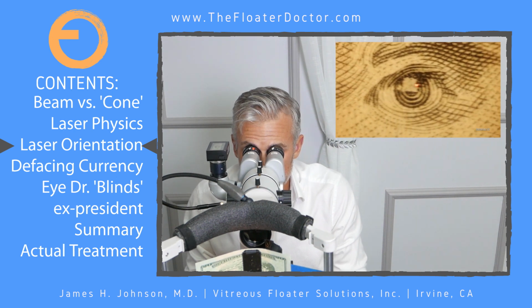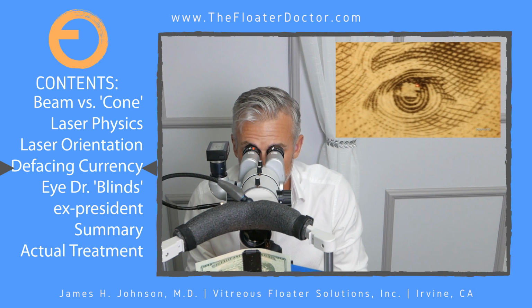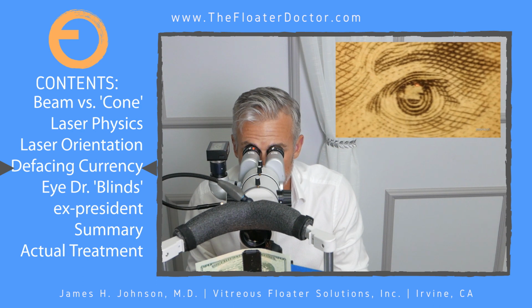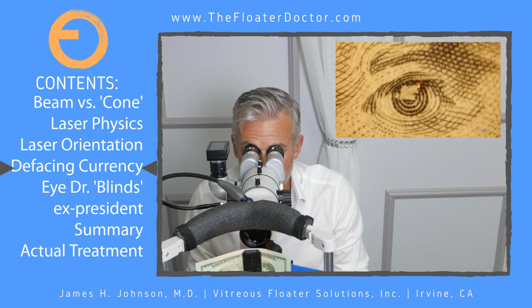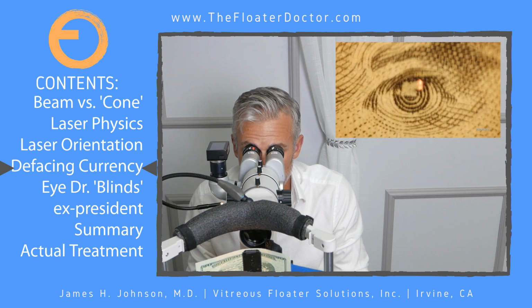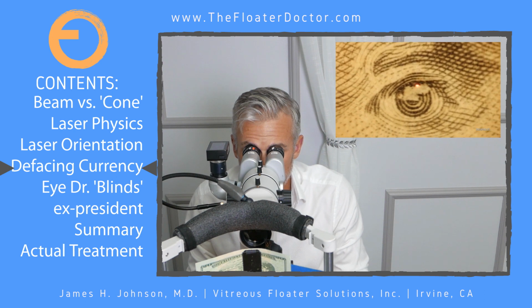So I've already made a few shots here, and you'll see that as I fire away at that, I can very accurately remove just the ink off the surface of the paper and not affect the paper underneath it. And that's very precisely focused, for instance, in that area. If I just move back just a little bit, I mean just fractions of a millimeter, you don't get nearly as much punch out of that. That's not really much happening there. So it really does need to be focused very, very precisely. If I move much further back, yeah, you'll get a little bit there. And so that's how that works.